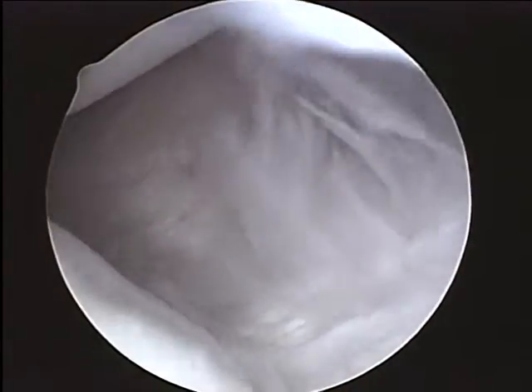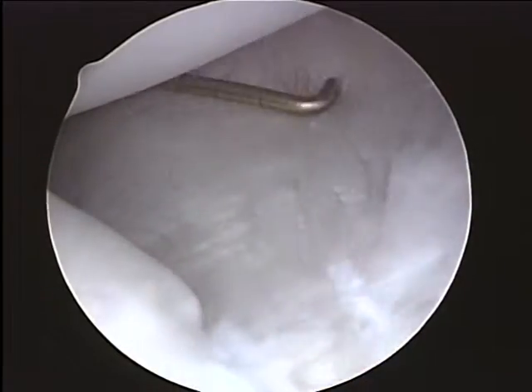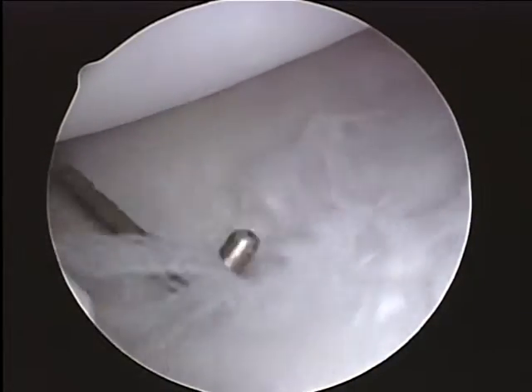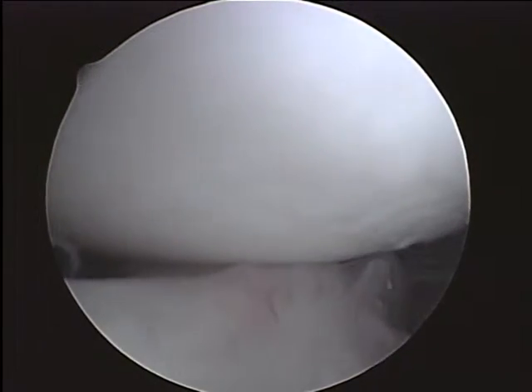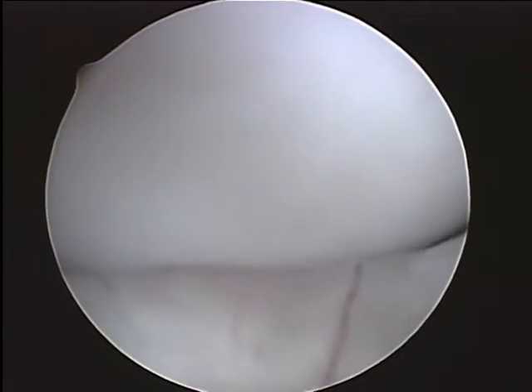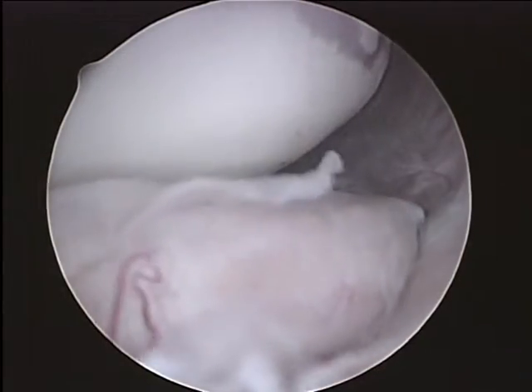As I come to the front, I don't think that the screw is going to be visible inside. I think the screw is all on the other side of this tissue here, the anterior capsule. I wonder if there even was a little bit of bone as part of that. So for sure, we need to take that bit out, and that may be a lot of your mechanical symptoms as well.